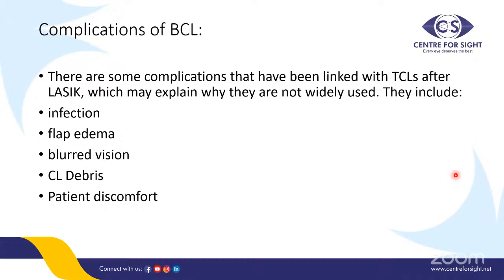So there are various complications of BCLs which are linked, especially after refractive surgery, such as infection. Post LASIK, there may be some signs of flap edema, followed by blurring of vision. There may be meibomian gland secretion or debris that can settle underneath the contact lens, and occasionally BCLs may also cause patient discomfort.